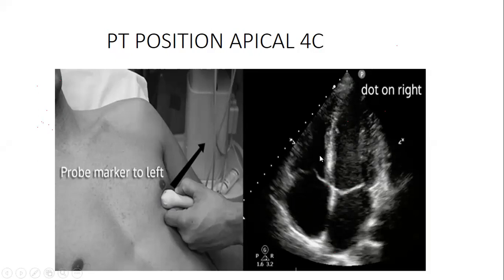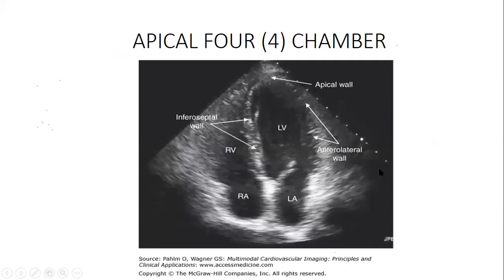Left, right. If this is the right ventricle, this is the right atrium, left atrium. This is the septum, the IVS. Then from there to there, we've got the atrial septum, and then the rest continues. We move. Again, this is how it will look.